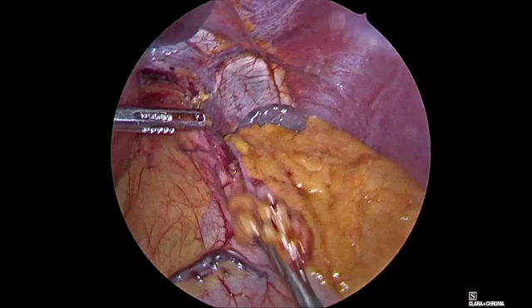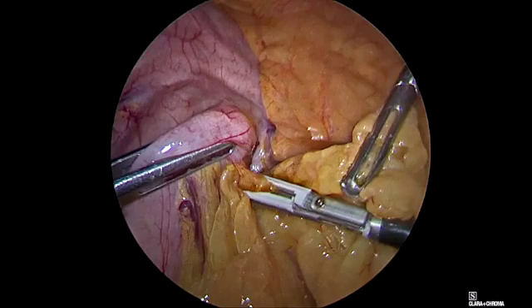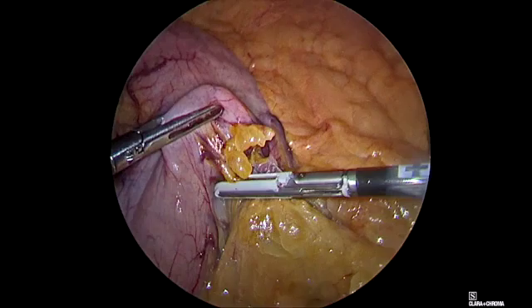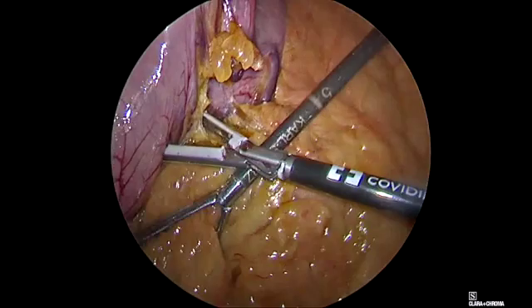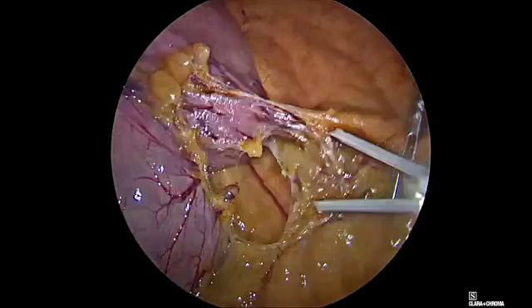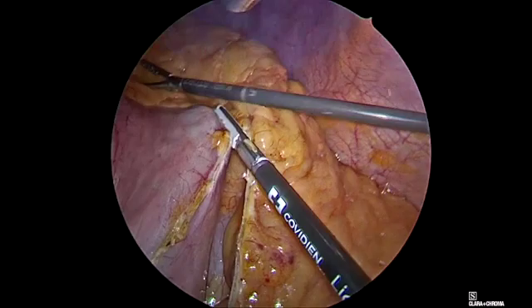Now we start to release the greater curvature using a bipolar sealer and cutter. In the face of bigger vessels, we use double coagulation — we coagulate first and then in the same spot, by the side, we coagulate first and then cut. With this double ligation it is very rare to have any significant bleeding.